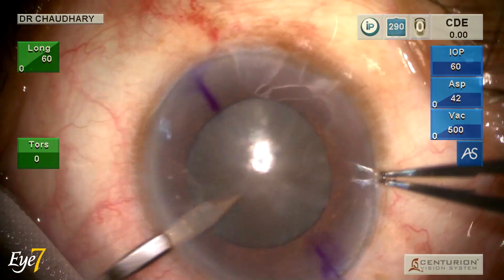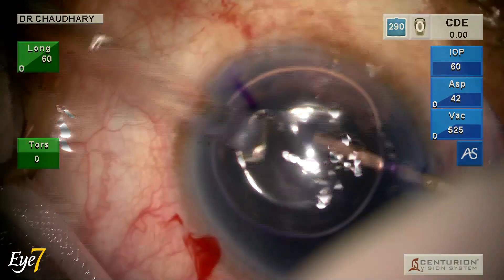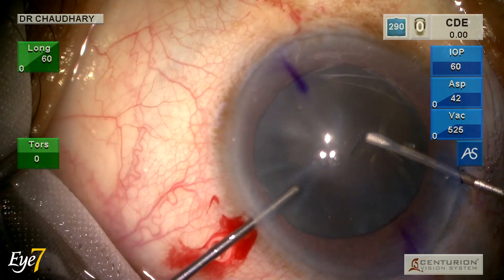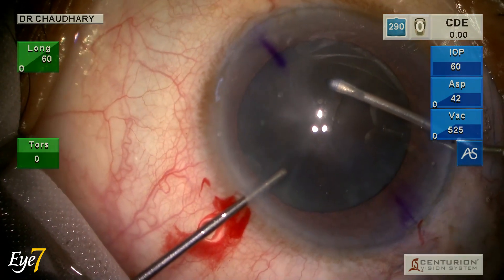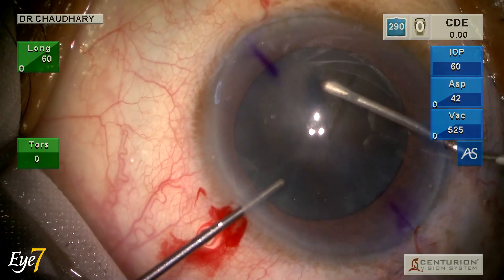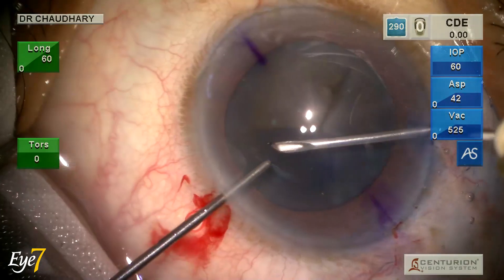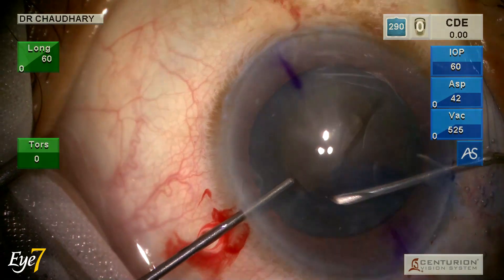The side ports are made, staining the anterior capsule because the visibility is not good. The main incision is made, and the capsulorrhexis is a little larger than normal size — if my normal capsulorrhexis is 5 mm, this would be about 5.5 mm.